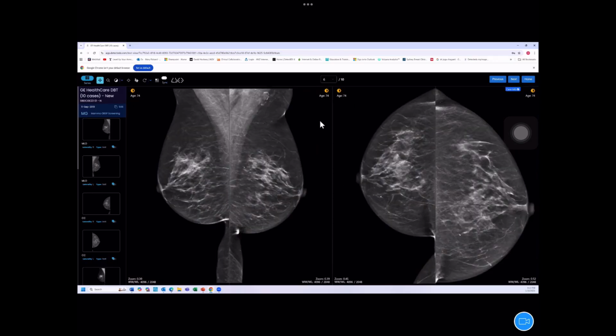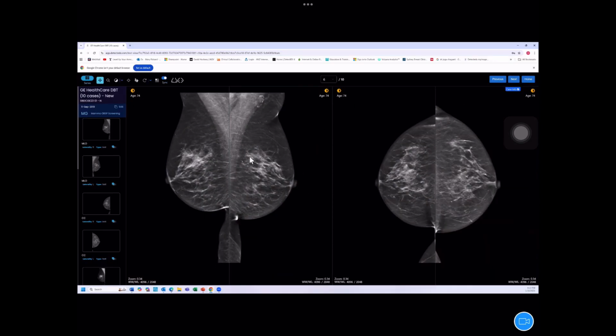So I might take us back to the 4 pictures. I think I've got the next one here. Just sync these a bit. So coming back, where is it? The little tumour is in here on the tomo and on here on the tomo. But coming back to the original 2Ds, I think it would have been a very hard cancer to diagnose. So given the time, I won't take you through the last few cases.